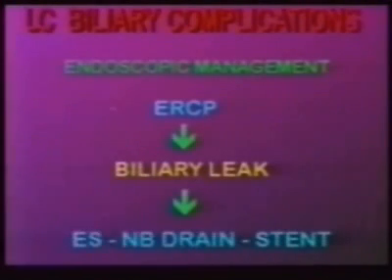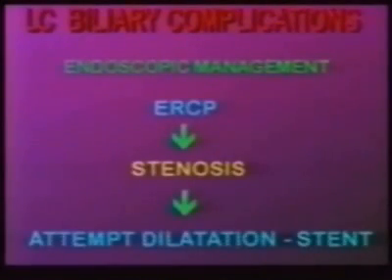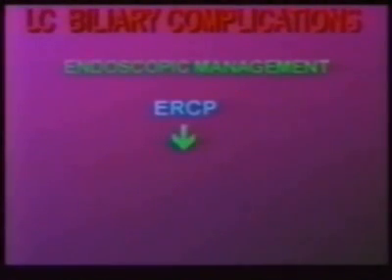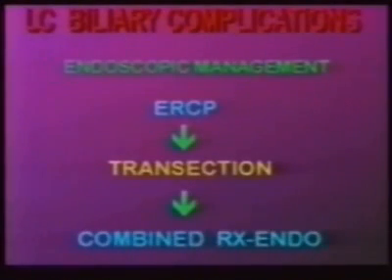ERCP allows for accurate assessment and treatment of biliary complications. Leaks are managed by endoscopic sphincterotomy, nasobiliary drainage, or stent. Stenosis, early and late, are treated by dilation and stenting. Finally, transections have been treated at our department by an original combined endoscopic radiologic approach.